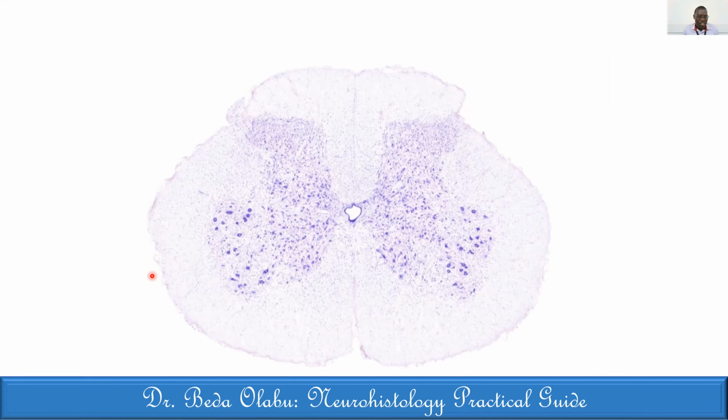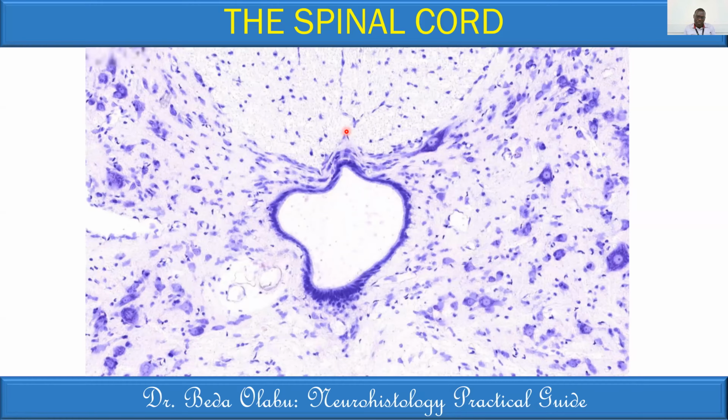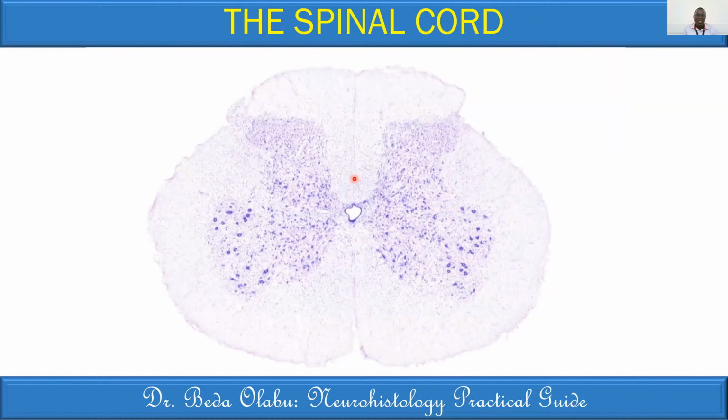All right, very good, thank you. So this is a cross-section of the spinal cord. And the reasons you've given are very okay, doc, that's fine. So when we talk about the spinal cord, there are some things to note about its structure.